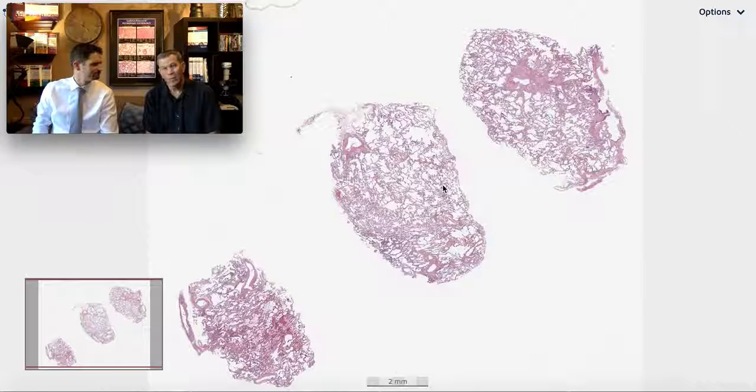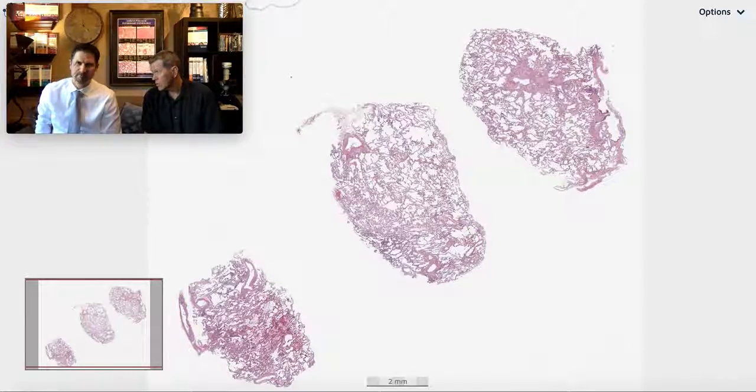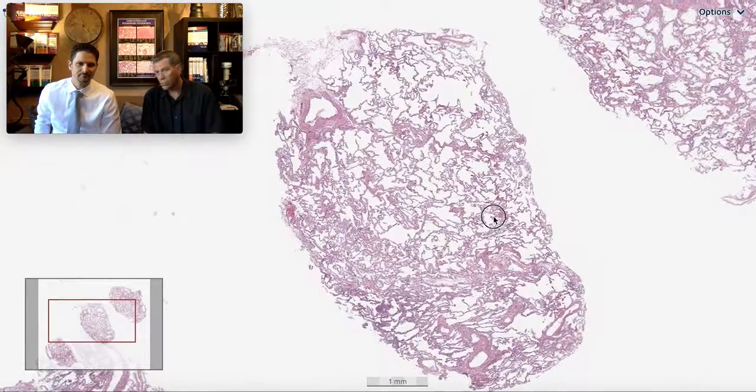What's a cryobiopsy, Kevin? It looks like a little surgical biopsy to me. It certainly is no transbronchial biopsy I've ever seen, and they do the cryobiopsy through the bronchoscope.